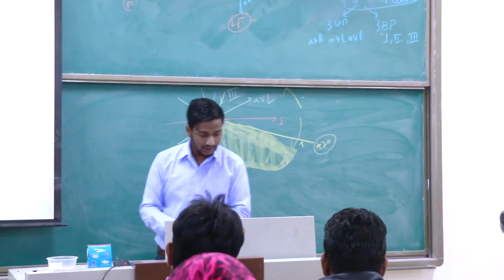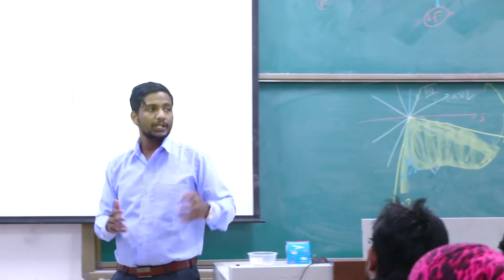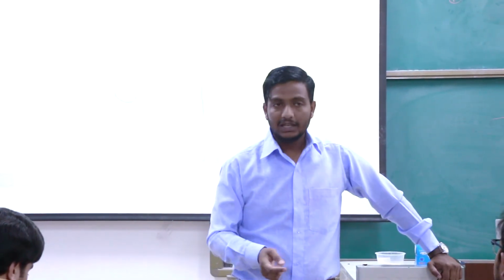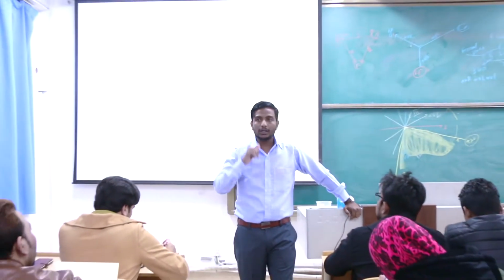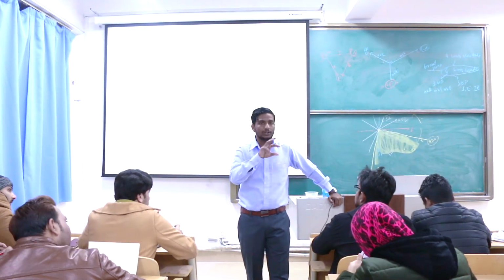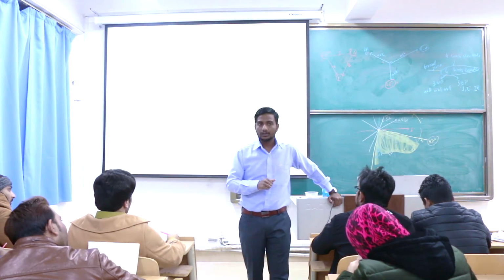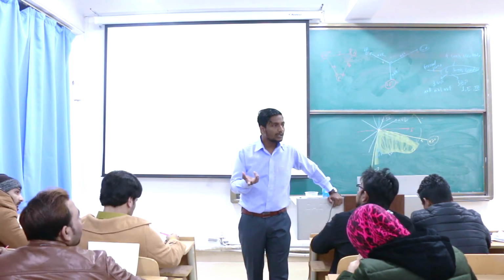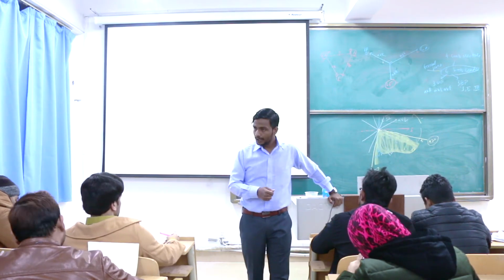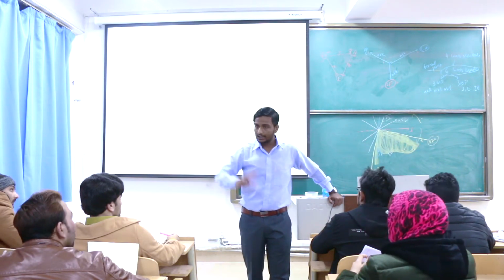Now let us go for the chest electrodes. Can you give me an example of chest electrodes? V1 to V6. And as soon as you find the letter V, what is the meaning? Will they behave alone or work in a group? Alone. And if they are working alone, will they behave as positive or negative? Positive. And the negative will be? The center of your heart or center of your body. And what will be the axis of the current coming from the center of your body to the electrodes?